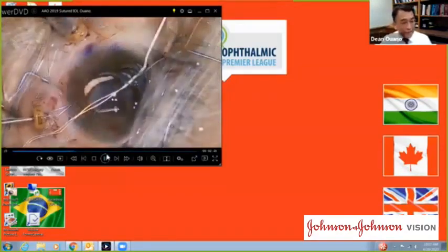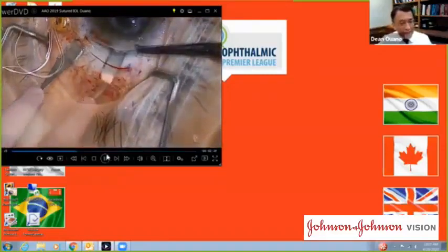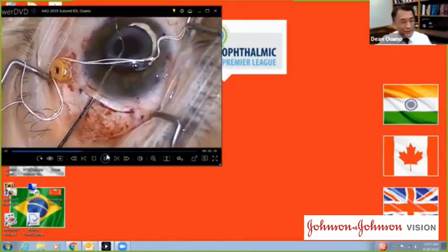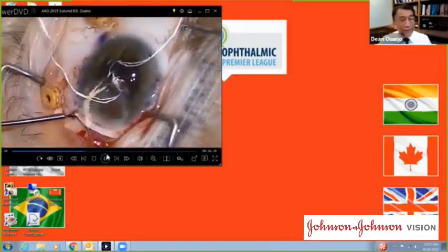So you do a vitrectomy to clean up any vitreous traction. You'll need a 7.5 millimeter incision to implant the new lens. Notice as this lens is coming out, you'll see a pro-inflammatory Soemmerring's ring. And this is one of the reasons why I stopped using lasso suture fixation.